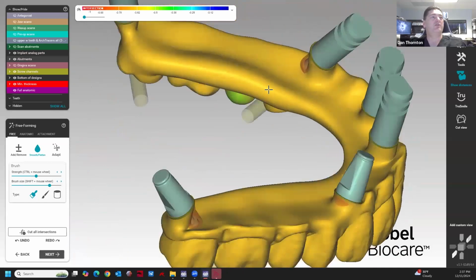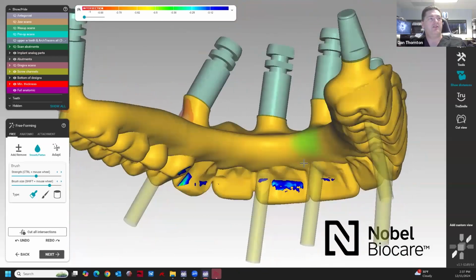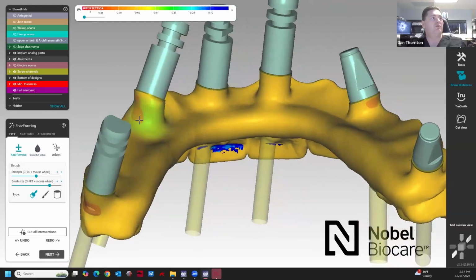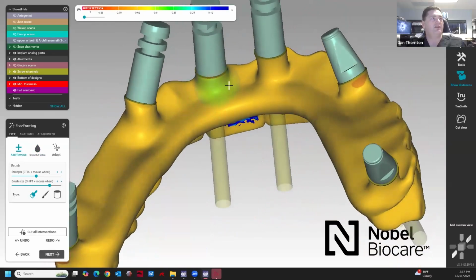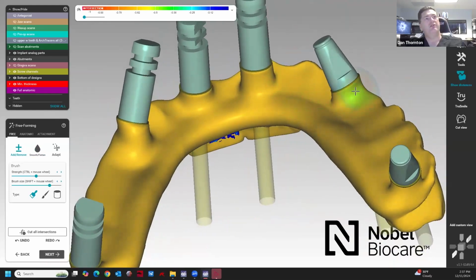It depends on what surgeon I'm working with. If I know they're going to be an FP1 or FP2. If I know we're going FP1, I normally just have the teeth hanging out there. And then I'll just adapt all the tissue and everything to them. I'll form the tissue a little bit better to go in the sulcus. That way it's a little bit more like an FP or regular crown and bridge case.